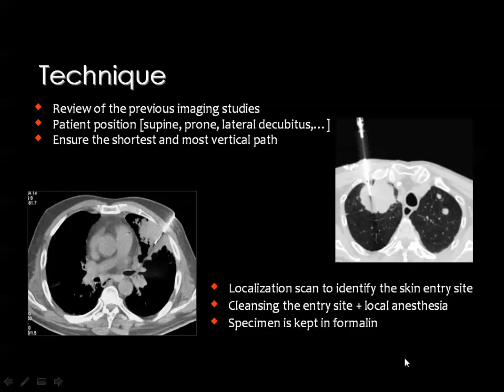And here is the technique. You review the previous imaging studies, then you put the patient in the position which is accessible for biopsy.